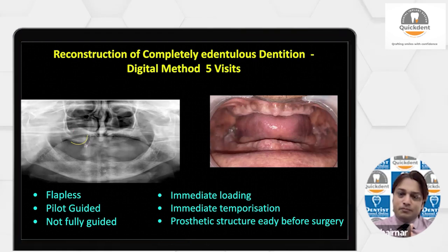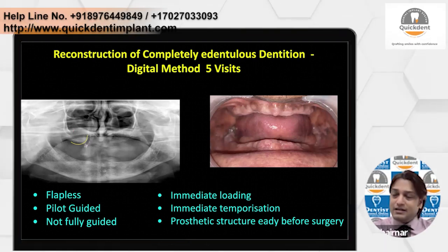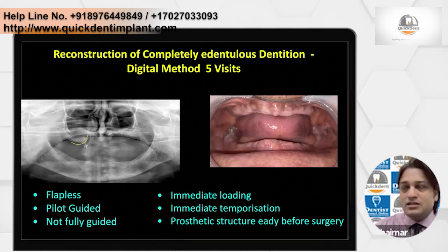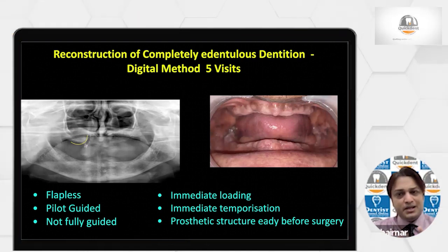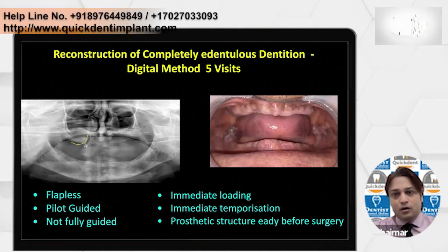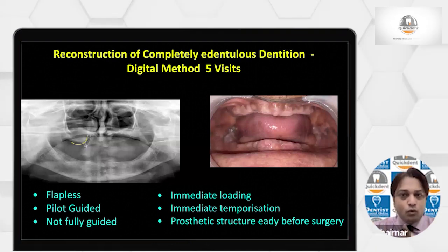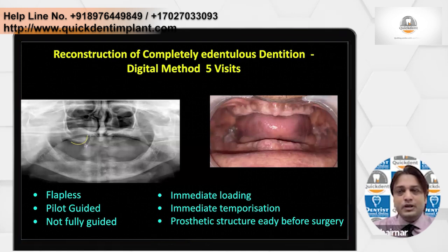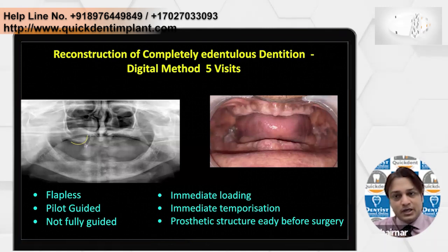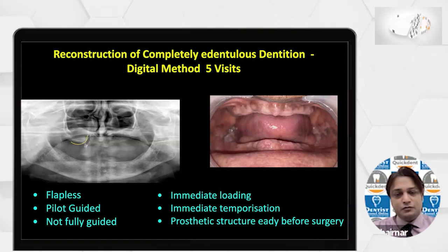So this case we also did, but with the guided approach. Not fully guided, but pilot guided. Now what is the difference between pilot guided and fully guided? Pilot guided means that with the guides, you will do only one drill. Only the pilot drilling is possible. After that, for any sequential drill you have to remove the guides, so you get an orientation of the direction, but you will not do the complete procedure. And what is fully guided? That means all the drills you will be doing, and at the same time you will place the implants through the guides also. That is fully guided.